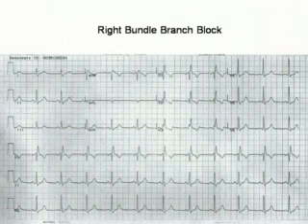left ventricular QRS. Now, one thing of note about right bundle branch block is that since the right ventricle points right and anterior, and the left ventricle points left and posterior, with them no longer depolarizing at the same time, it may become very confusing when you try to figure out a mean electrical axis. And since the right ventricle is the second sister of cardiology, what we'll do is discard the right ventricle for calculation of axis. So if I look at this and say, well, what's the mean electrical axis? I'm only going to look at the first 60 milliseconds. I'm going to use my left ventricular QRS for axis and just discard the terminal component.